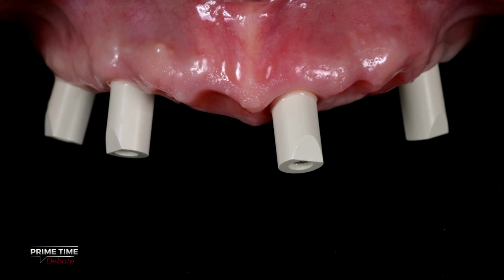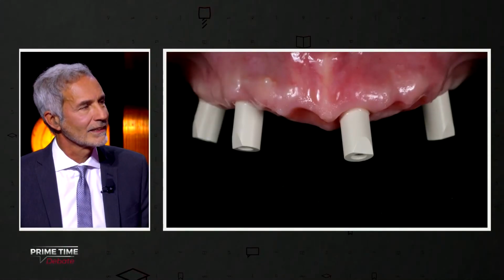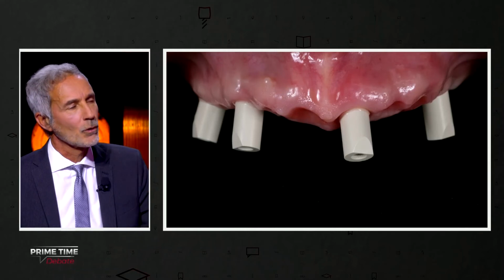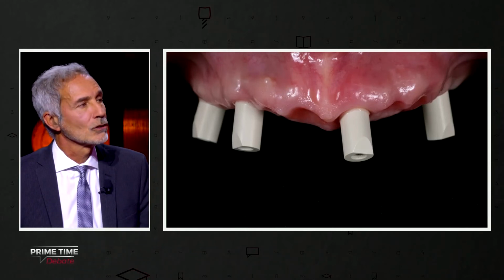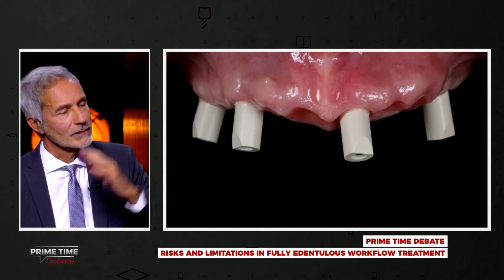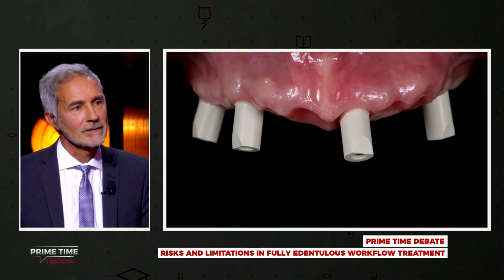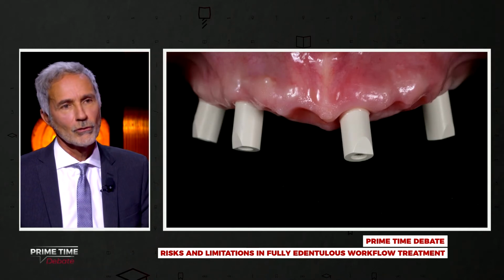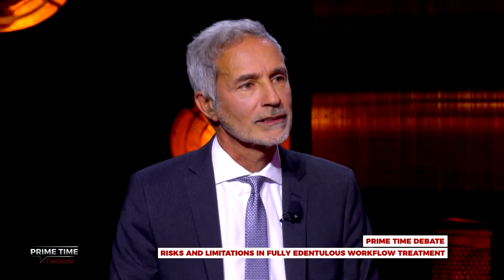It is very difficult, and the reason is that the oral scanner gets lost in the mouth. By not having any reference point, it doesn't know if it is on the last scan body or the frontal scan body, so a lot of mistakes can be added in the scanning procedure. We can use some tricks to correct this problem.